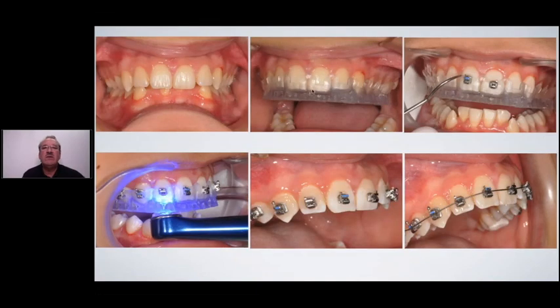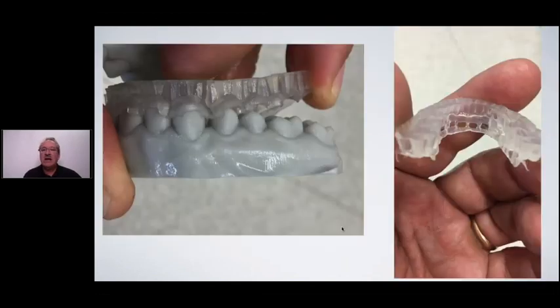So basically, you put this thing in the mouth here, you put your composite on the bracket, you place the bracket, you cure it like you see here, and basically you have no waste around the teeth of your material. A very, very fast way, very helpful way for doing this. There's now a new material coming out, which you can see here on the right-hand side.